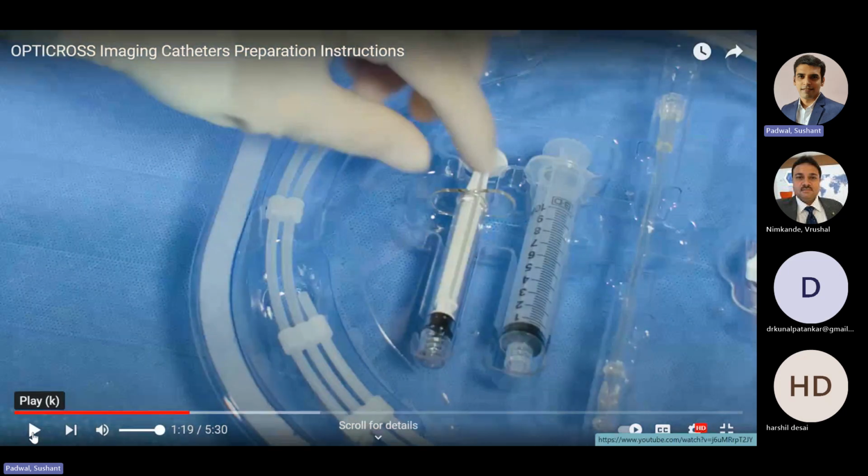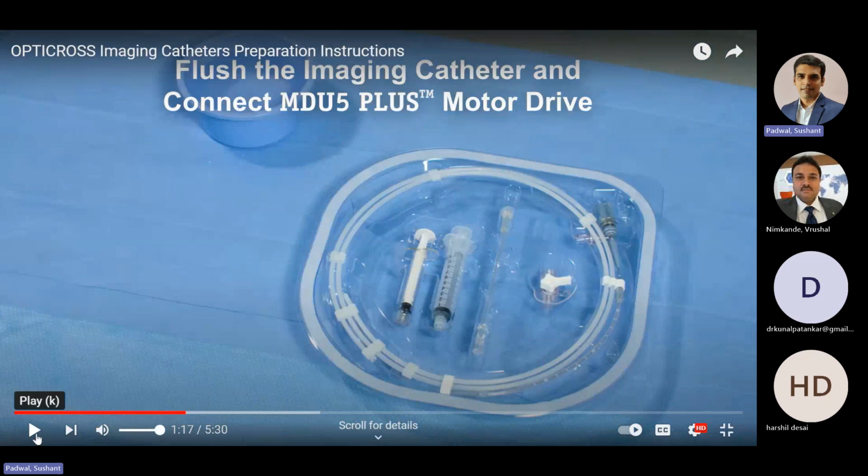So these are the things which are available in the IVUS catheter packet. One is a 3 cc syringe. Another one is a 10 cc syringe, a 10 centimeter extension, a three-way cock, as well as the IVUS catheter. To prepare the IVUS catheter, we require heparinized saline. The combination is such: in 200 ml of saline, we put 1000 international units of heparin.